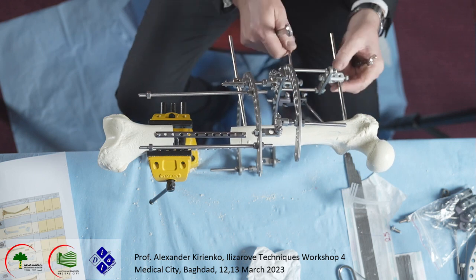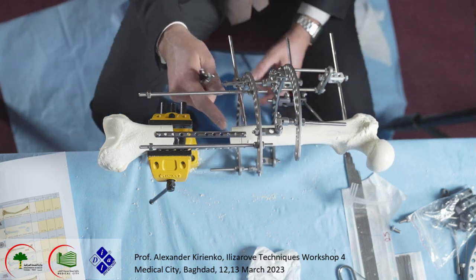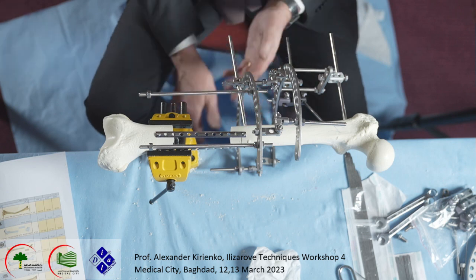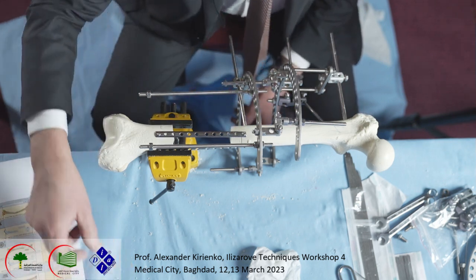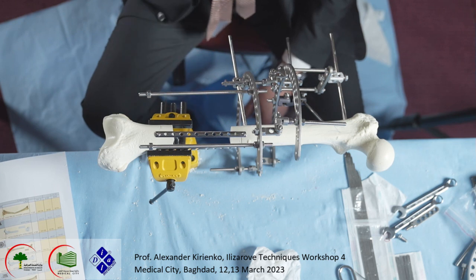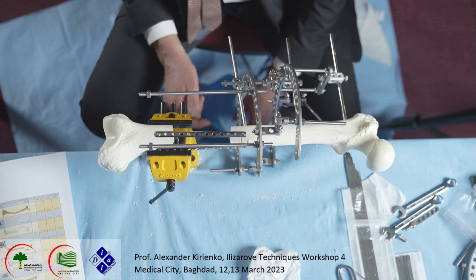Okay, the proximal system is now really stable. Later we may add another half pin here, but for now we don't do this. We may do it later. Yeah, because I need to put another one here. One or two.